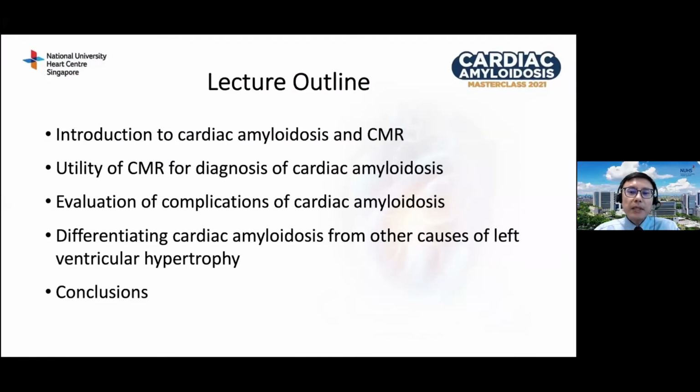In this 15 minutes, I will be talking about a little bit of introduction to cardiac amyloidosis and CMR, as well as how we use CMR for diagnosis, evaluation of complications in cardiac amyloidosis, as well as differentiating amyloid from other causes of left ventricular hypertrophy, and then some conclusions.